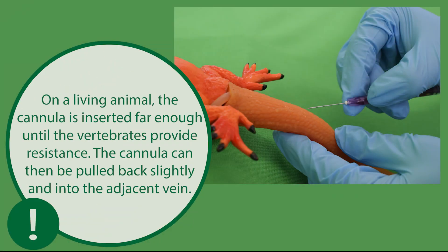On a living animal, the cannula is inserted far enough until the vertebrae provide resistance. The cannula can then be pulled back slightly and into the adjacent vein, allowing an aspiration of blood. This step cannot be done on the simulator.